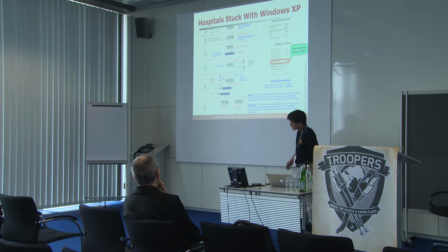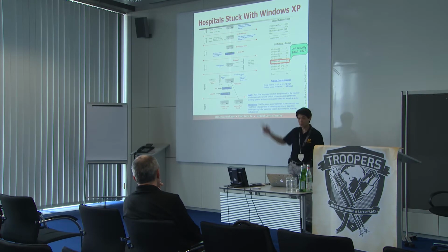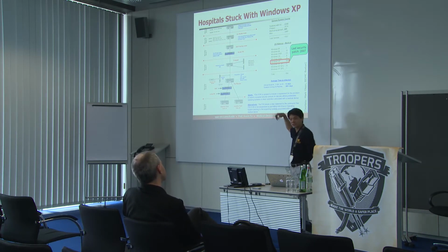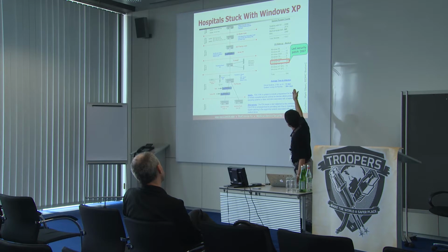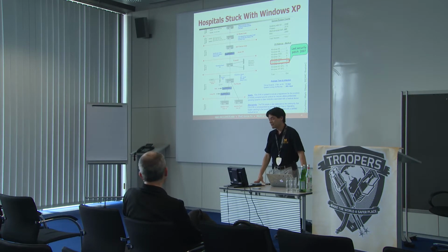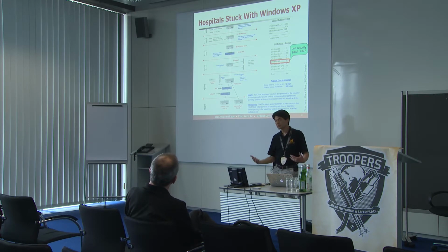So this fellow gave me a presentation a couple years ago, and he says, well, we've got 664 computers that are legally classified as medical devices. And so I always like to check numbers and add them up to make sure they add up correctly. So I looked at this. It said Windows XP, 600 devices. And I'm like, well, wait a minute. You know, if you add up Windows XP Service Pack 1, 2, 3, I get 16. I think you've got a typo here. And he said, Kevin, no. That's Service Pack 0. They have 600 Service Pack 0 Windows XP machines because the manufacturer and the hospital weren't able to come to an agreement on how to update the software.